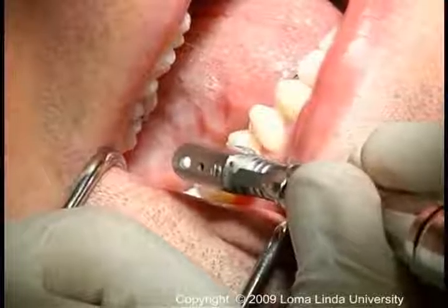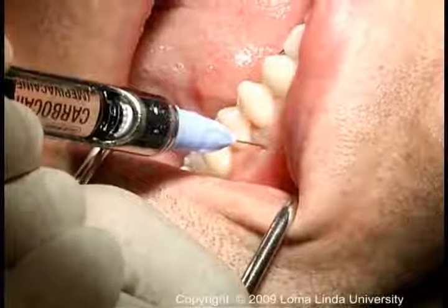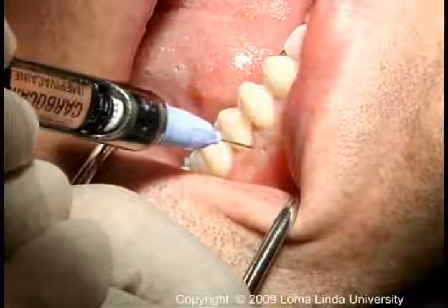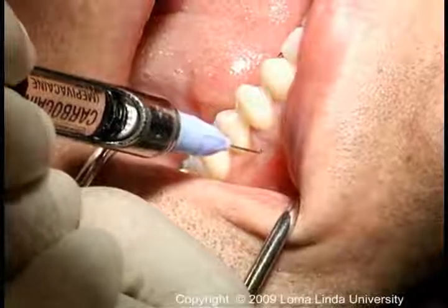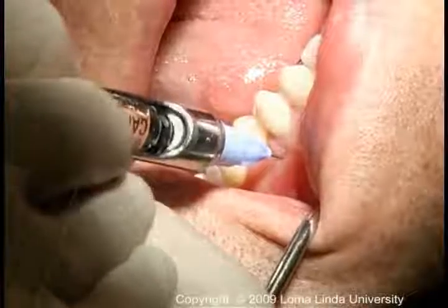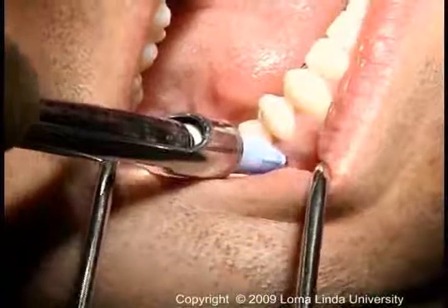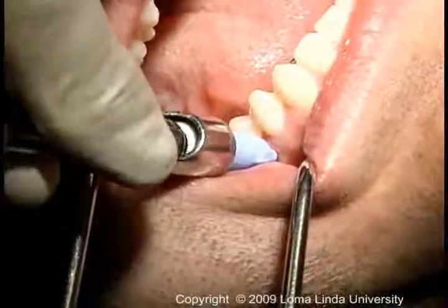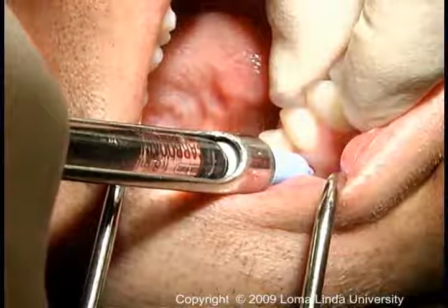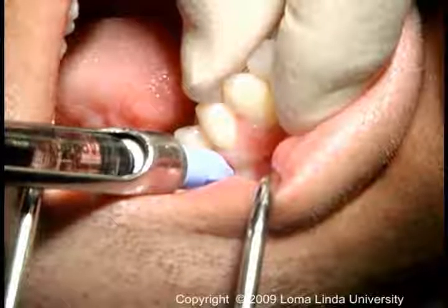into the medullary bone. The needle must be positioned exactly in the same spot and in the same orientation as the perforator. Otherwise, it will not penetrate and be in proper position. Some maneuvering is often required. Place the needle to its hub against the tissues to minimize leakage of anesthetic into the oral cavity. Approximately a half cartridge is injected under some back pressure. Note the blanching of the mucosa.